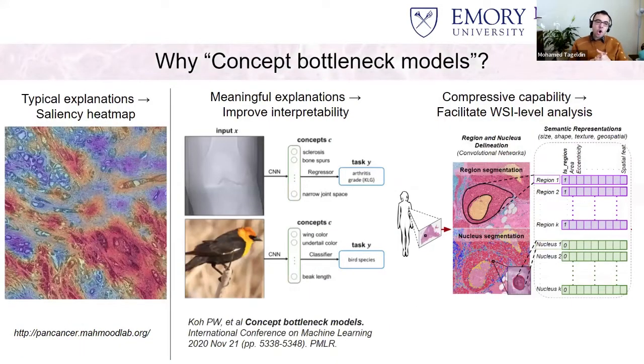So going back to the idea of why are we interested in the type of detecting individual elements that I talked about in the first slide. So one famous approach to understanding what the models are doing is to link one slide to one prediction. So to say, for example, this is a slide of invasive breast cancer from patient X. This is what the heat map looks like of where we think the model is looking when it's making the predictions it is. Therefore, we try to infer that this is why the model is making the predictions it is. It's a pretty indirect way of making predictions, and it has its merits. It has a lot of merits, especially that it's the best way to make use of the limited data if you have one label per slide.